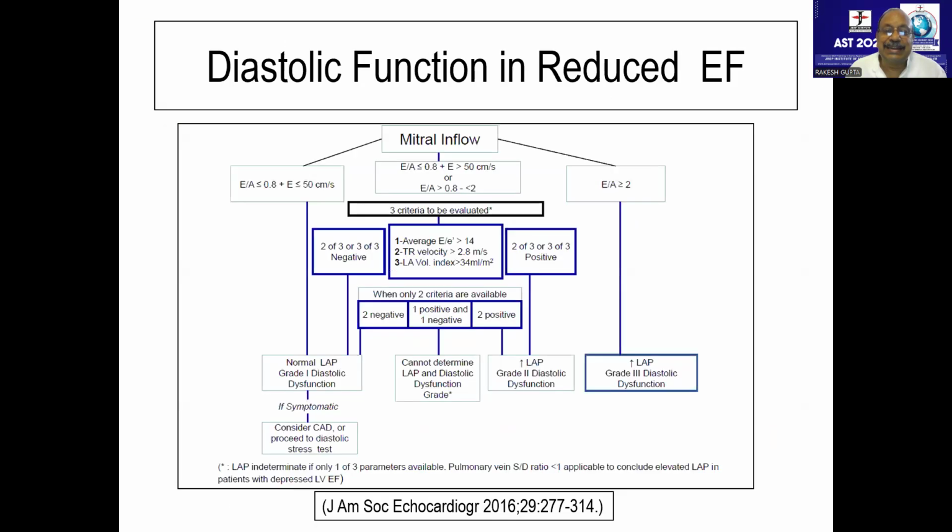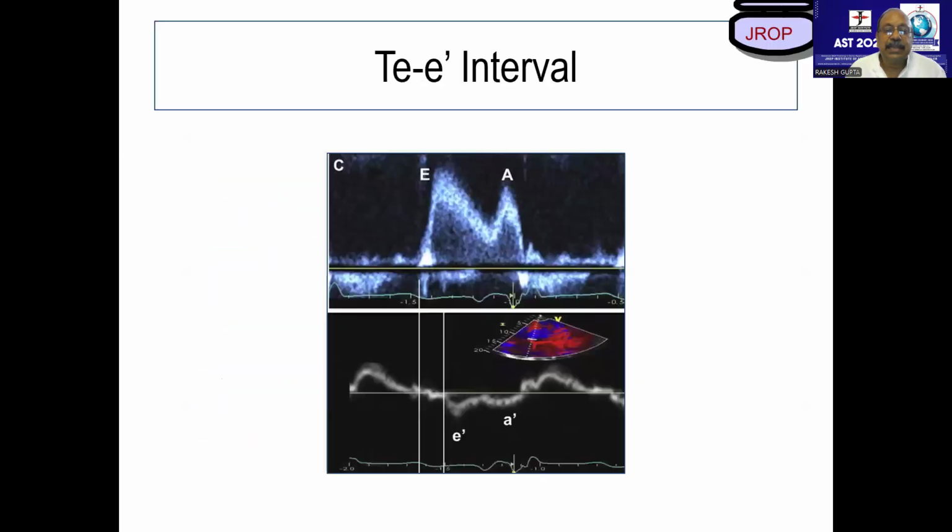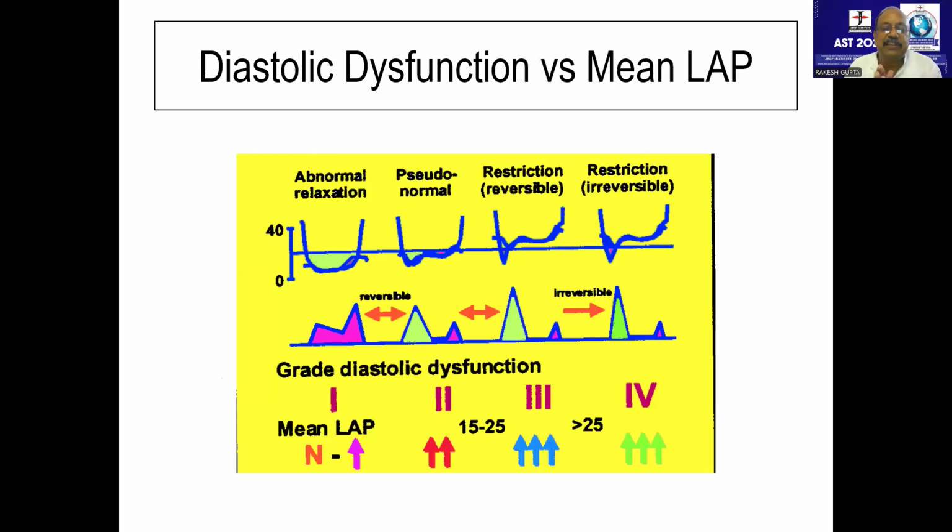What was exactly happening earlier was, in our previous time when we started looking at echocardiography, we said only 3 types of patterns are present: one is normal, second is grade 1, then grade 2 or grade 3. In grade 2, if you happen to see this kind of a pattern which appears to be normal, ask the patient to do Valsalva or hold his breath.